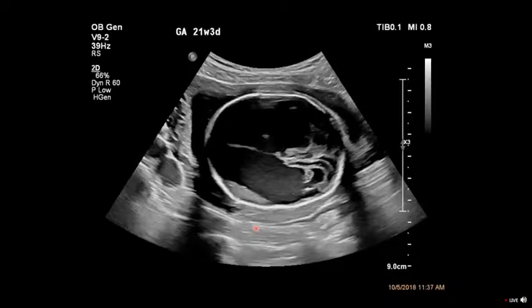There's an intact cranium, so you can see the skull all the way around here. There is a midline separating structure, so probably not holoprosencephaly. You don't see the choroid plexus or the ventricles or the thalamus. You see a lot of fluid. What do you think this is? Is it a bleed?